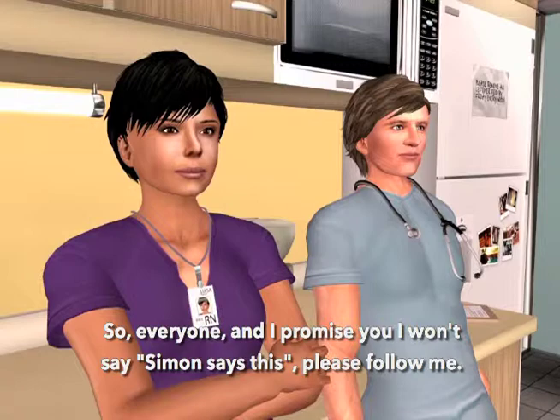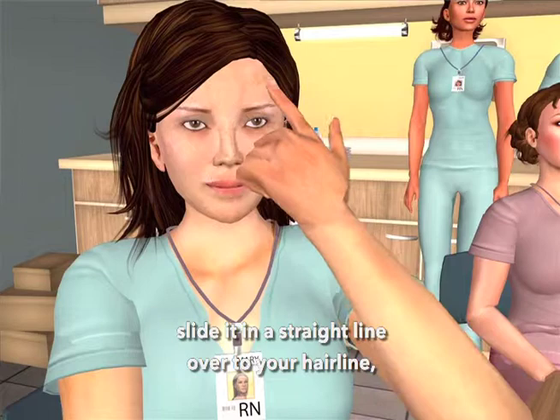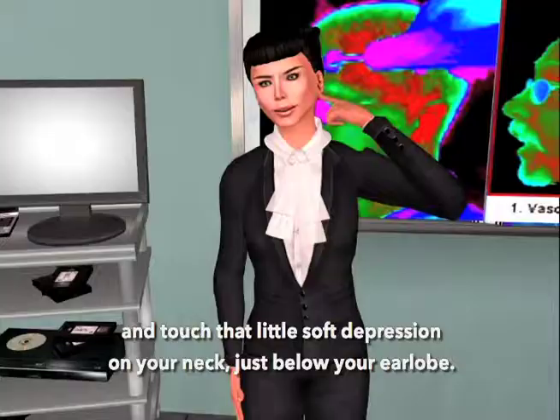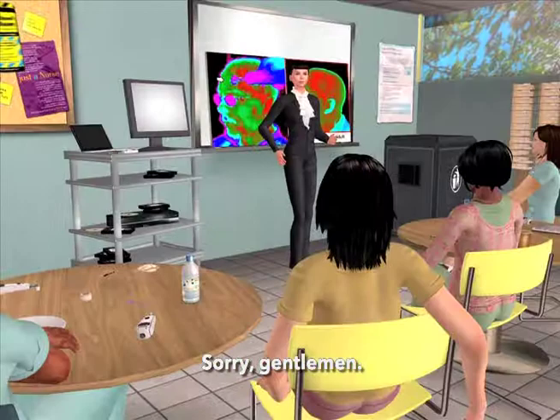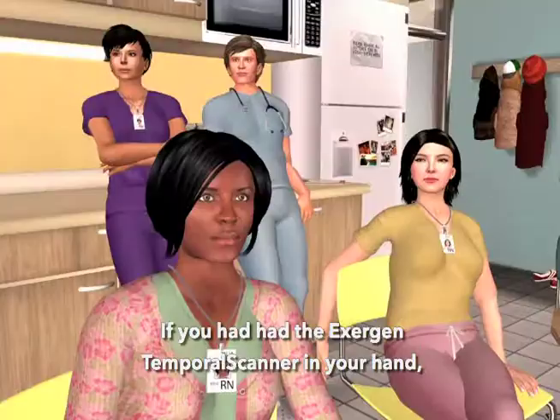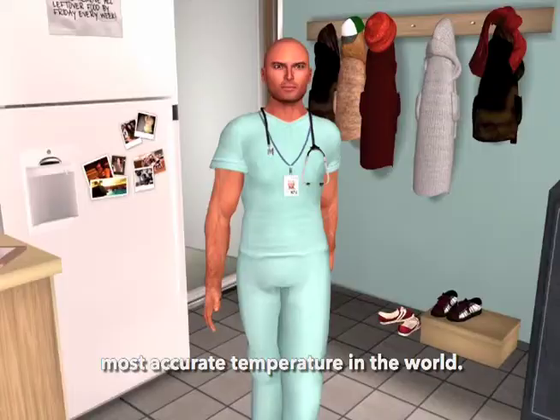Place your finger in the center of your forehead, slide it in a straight line over to your hairline, lift your finger off your forehead, and touch that little soft depression on your neck, just below your earlobe. It's the place where mom used to teach us to put perfume — sorry, gentlemen. If you had had the Exogen temporal scanner in your hand, you would have just taken the fastest, gentlest, most accurate temperature in the world.